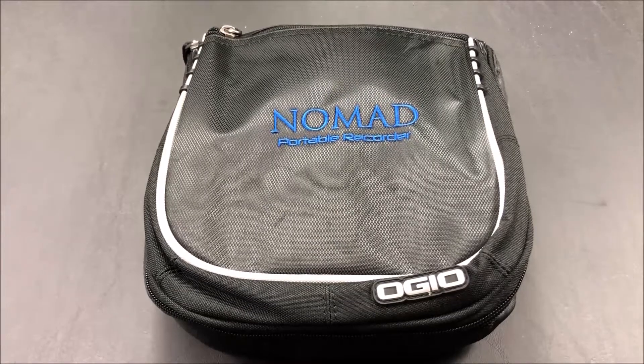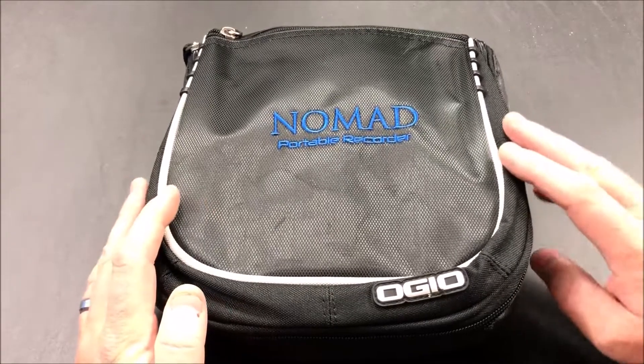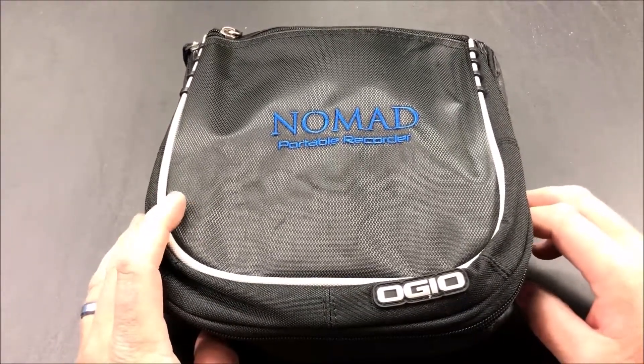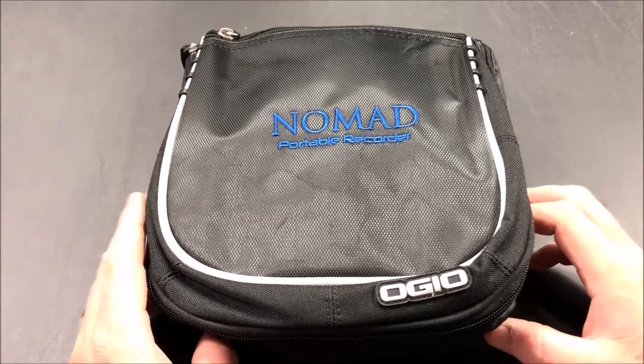Hey guys, it's John from John's DIY Playground. Today I wanted to cover this device that's going to be used for a home sleep study that I'm going to be taking. I want to show you the components inside in case you're curious what it's like for a home study in 2019.